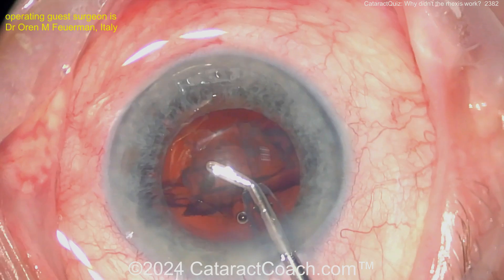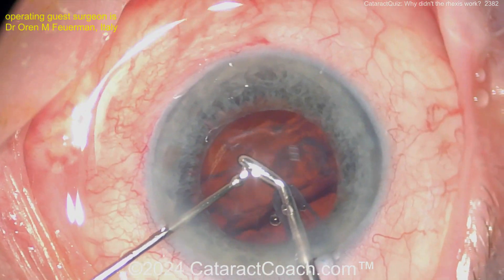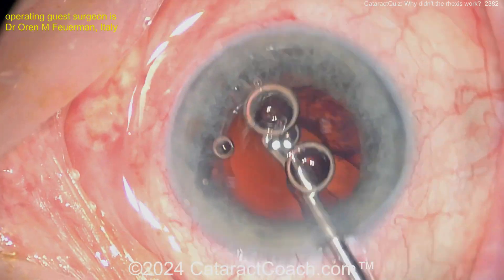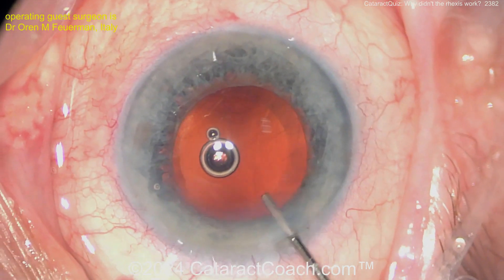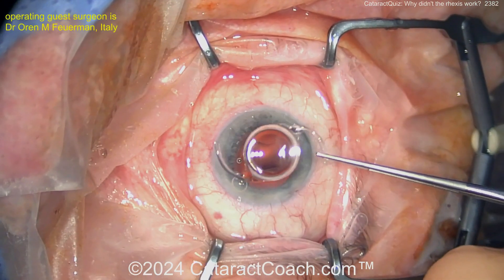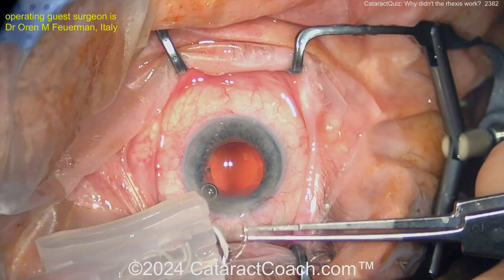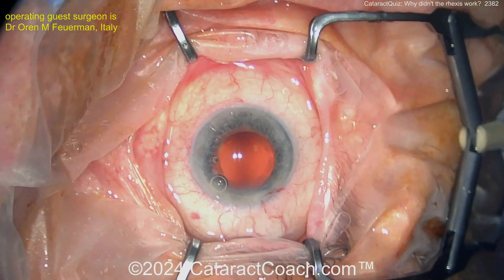So again, this is a doubling of the anterior lens capsule. We've featured a similar video before on cataract coach. The beauty of what we do on cataract coach is you can see this unusual case and put it into your mind's library of surgical knowledge — so if you ever encounter a case like this, you'll say, 'I saw a video about this, I know exactly what this is.'